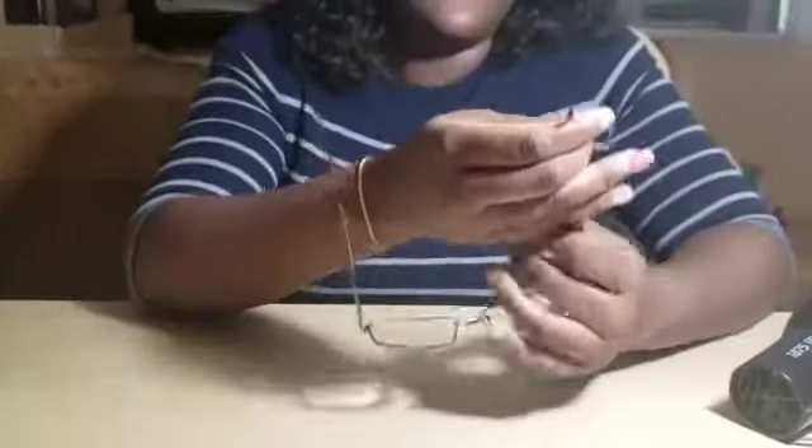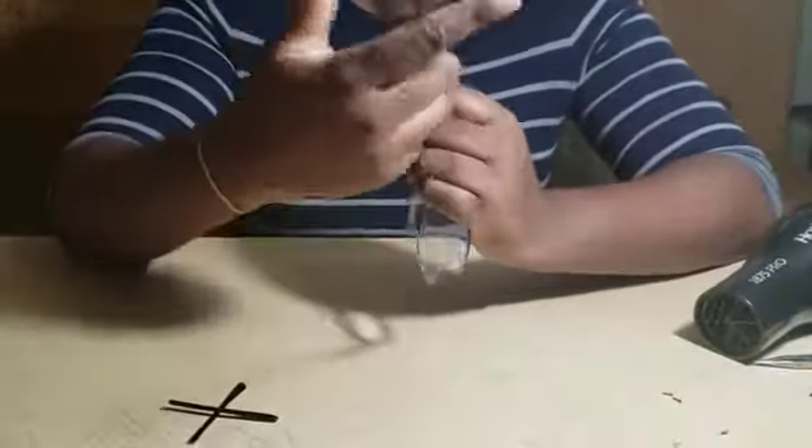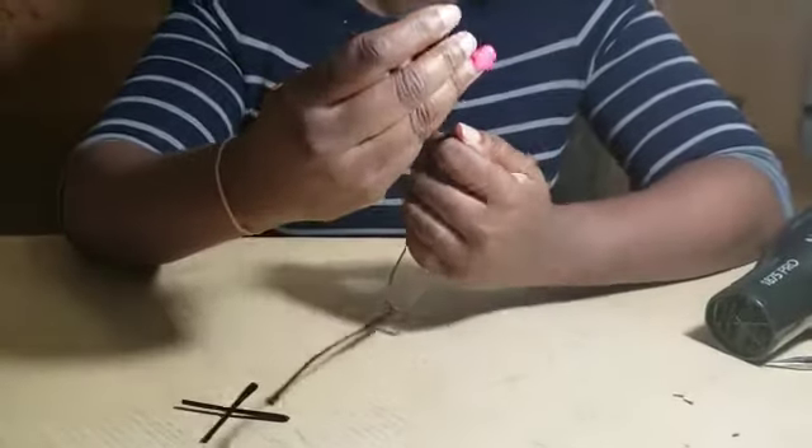We're going to do that to the other side as well. Secure the frame and use your fingers to bend it into a straight motion.